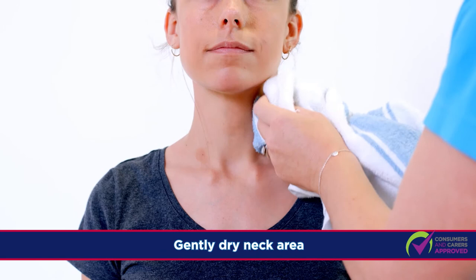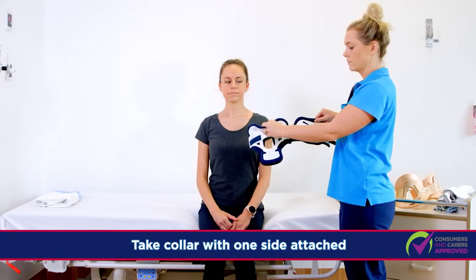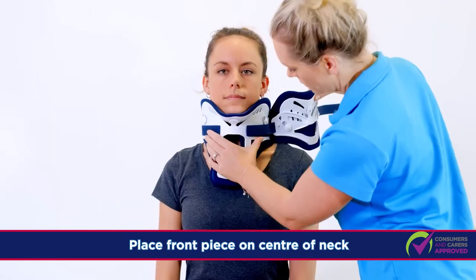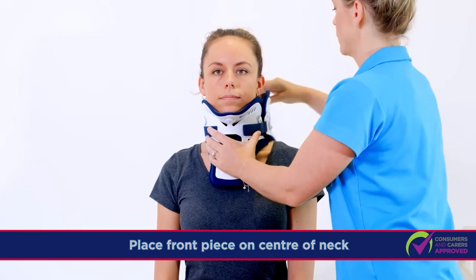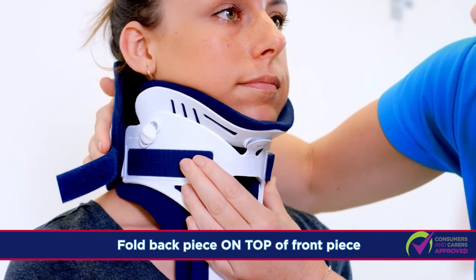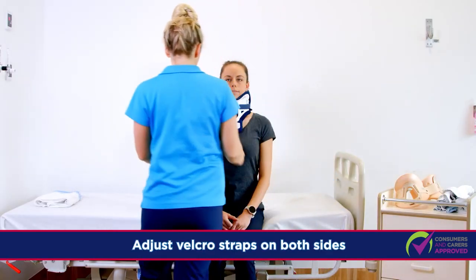Gently dry the neck with a towel. Take the Miami J collar with one side still attached and place the front piece on the centre of the neck. Fold the back piece over the back of the neck and position on top of the front piece and secure with Velcro. Adjust the Velcro on both sides as needed.